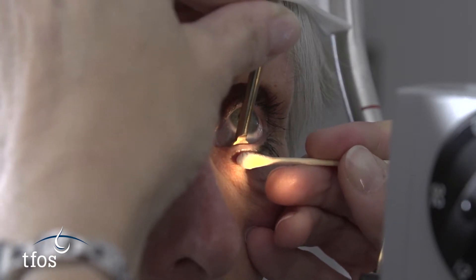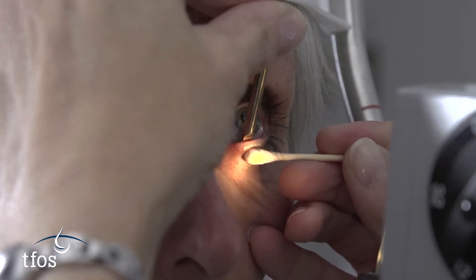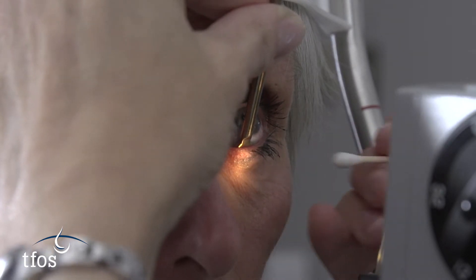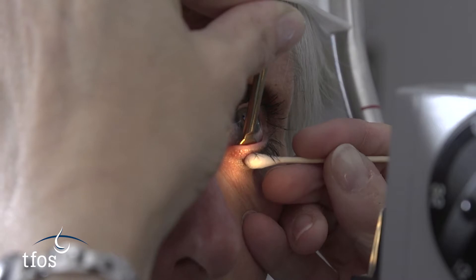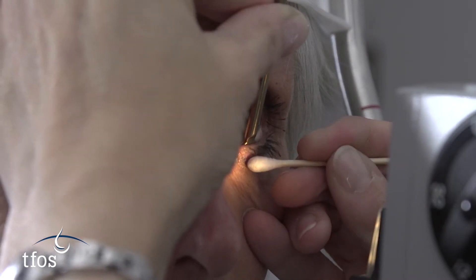Compressing the internal and external lid surface between two cotton-tipped applicators can also work, although more popular is the use of a smooth metal paddle on the inner lid, combined with a cotton-tipped applicator or digital pressure on the external surface, as the paddle provides a more rigid surface against which to apply pressure without affecting the globe.